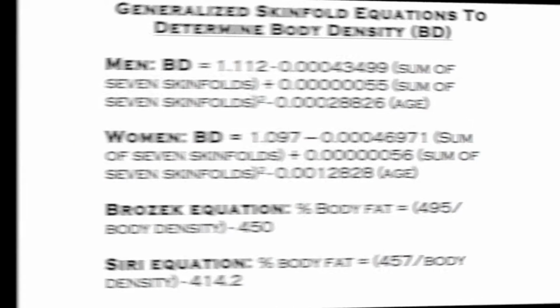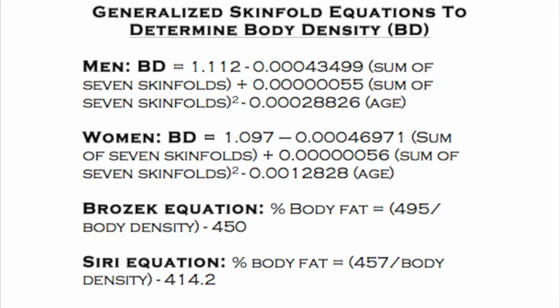It is important to remember that all measurements are taken in a rotational order to allow the skin to regain its normal thickness, as a minimum of 2 measurements are required per site. Once all sites are measured, you can calculate the average of each site. If measurements are not within 2 millimeters of each other, then a 3rd measurement is required.